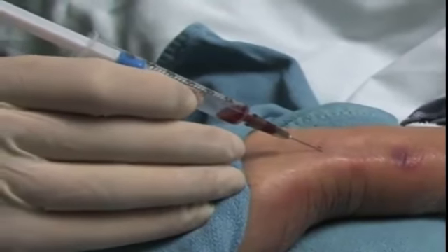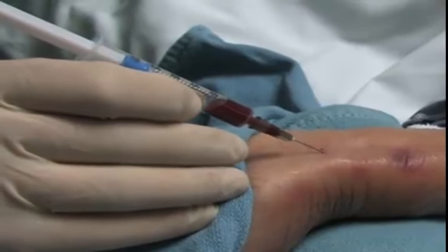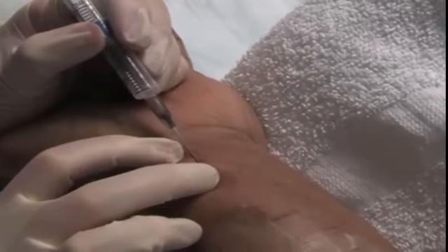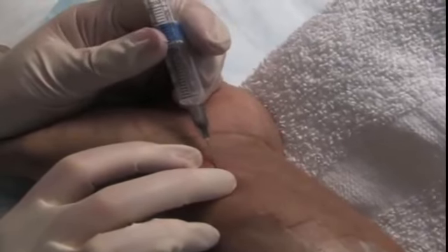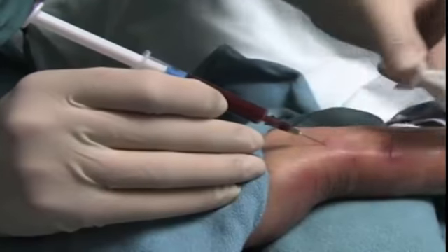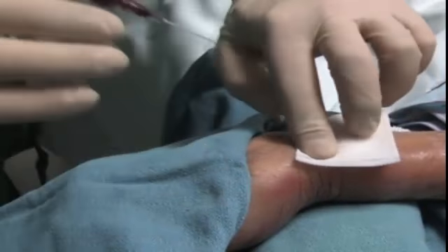Ideally, you should obtain at least 1 to 2 cc's of blood. If no blood is obtained, do not pull back on the plunger. Withdraw the needle slowly until it is just under the skin and reattempt the procedure. After the blood sample is collected, withdraw the syringe and have an assistant apply pressure to the site with sterile gauze for approximately 5 minutes.